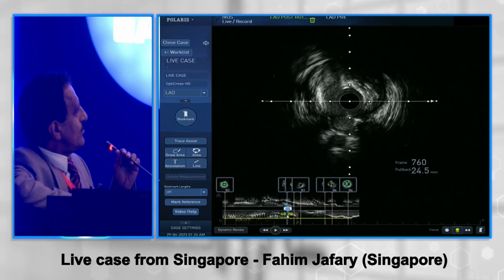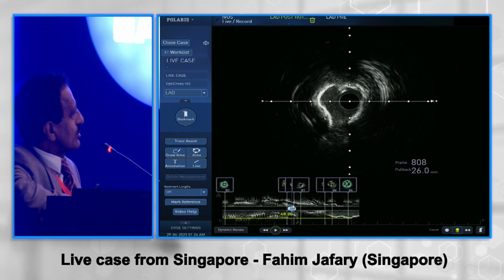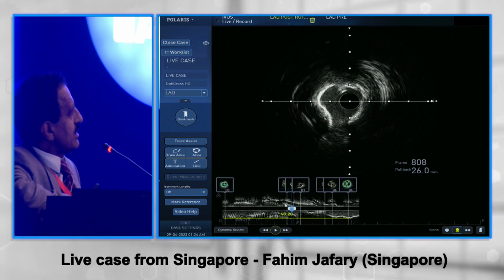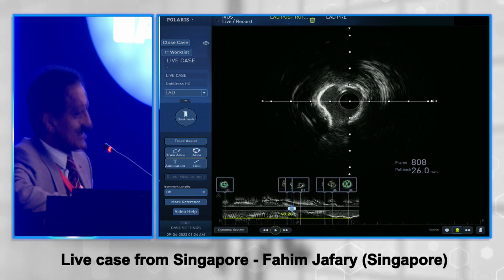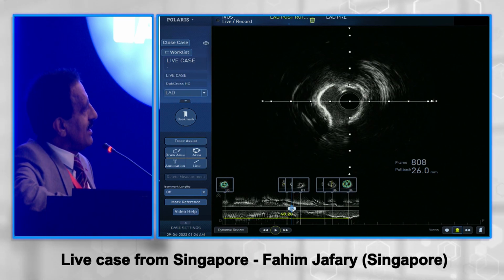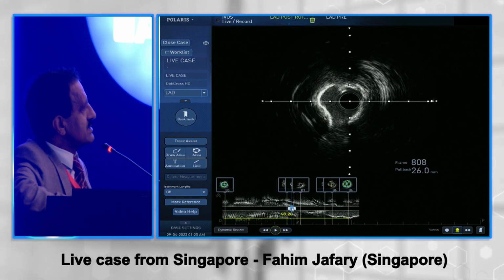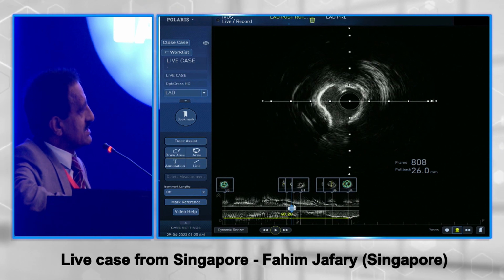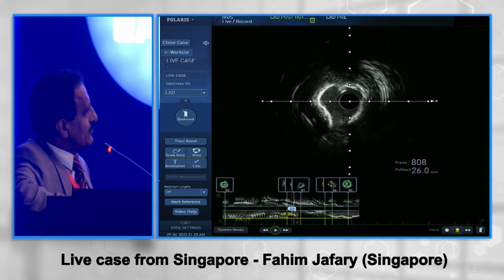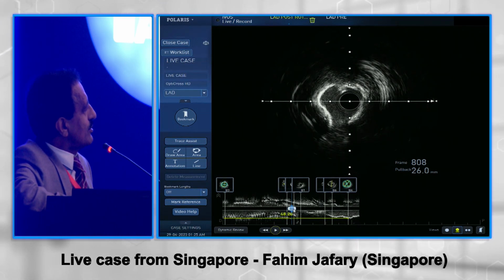I would like to welcome Dr. Ashok Seth online. Thank you very much, Ashok. Dr. Ashok is the president of the Asian Society of Interventional Cardiology. Thank you so much for joining us. We are doing this live case. I don't know if you joined from the beginning from Singapore. Fahim Jafary is doing the case, and it's basically a bifurcation calcified LAD disease. I don't know if you saw the pictures. If you have, then you can comment on that.